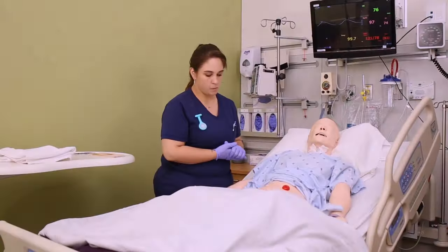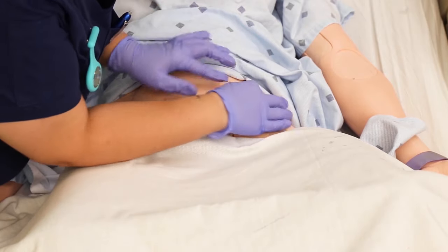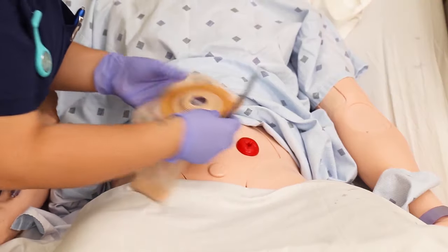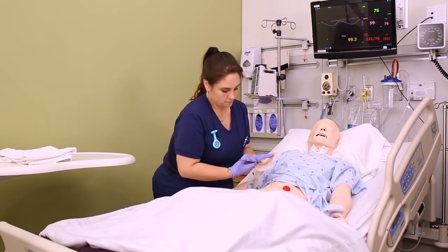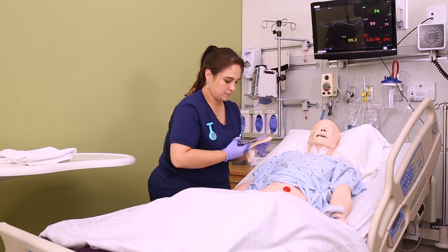Now that the stoma is clean you can do your assessment. You want to inspect the stoma itself — it should be light to dark pink and moist. What you don't want to see is dark red, pale, purple, or any kind of bluish color. None of those are good signs; they all represent problems with perfusion and should be reported right away. Also look for any skin breakdown.